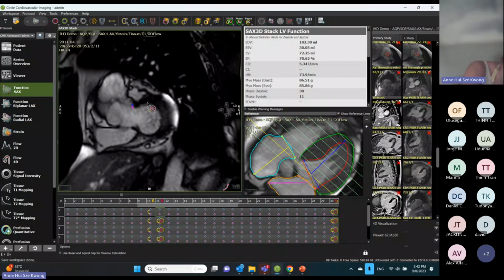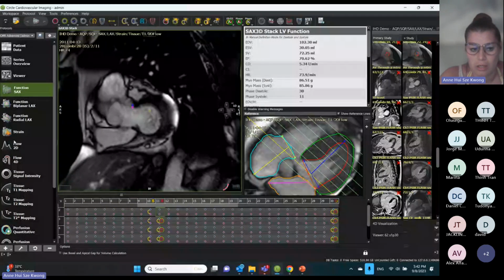Yeah, I saw the question from Alex. So yes, in the trial license, we will put everything. So everything that I spoke about, strain, which is one option, strain for different quantitative perfusion, that's 3 options. And we will include that. We will include strain and perfusion at least. And the basic package, that's the rest of the models. For the trial period, you will have everything.